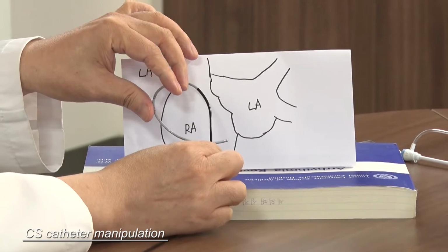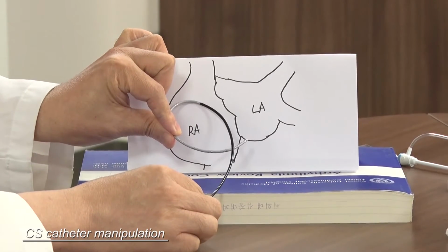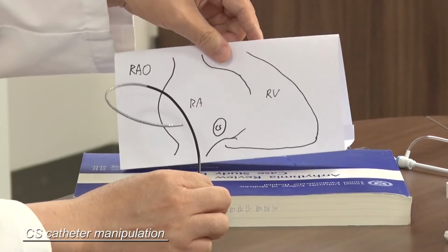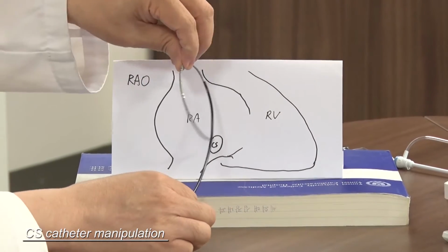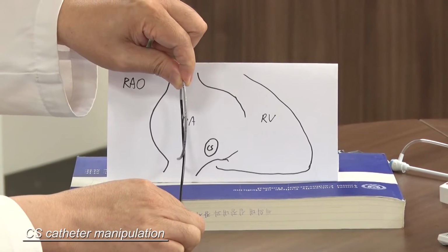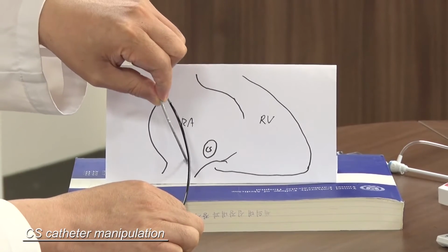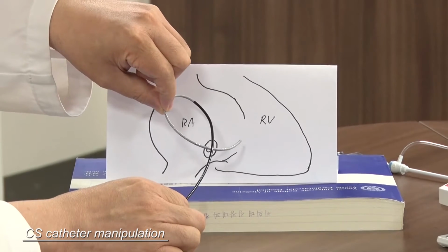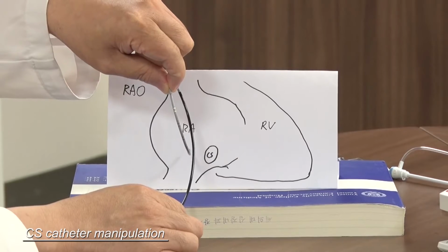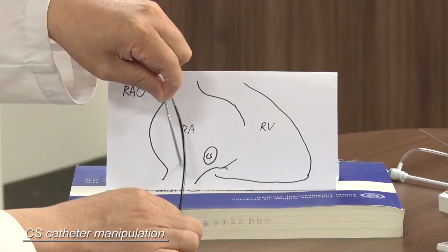So make a figure 9 position in LAO first. That is the first tip. And the second step is to make the RAO view. And then the catheter might stay like this. If in the RAO view the catheter position is like this, if you push the catheter, you cannot engage the CS. In this position, your catheter will move to the right ventricle. So if your catheter is here like this, how can you move it anteriorly?